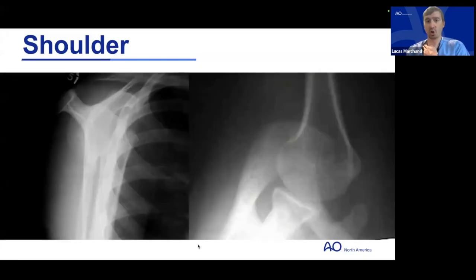And then here's a look at those two specialty lateral views. Dr. Stephenson, do you want to walk us through these? Yeah, so on the left is the scapula Y view. It's a very good profile of the scapula with the humerus overlaid on top. In contrast, the image on the right gives you a different perspective in terms of the joint surface. That's why you'll often hear residents taking call from the ER asking for not just the scapula Y view for lateral, but also the axillary lateral shown on the right, because it really allows you to visualize whether there's any subluxation of the glenohumeral joint.